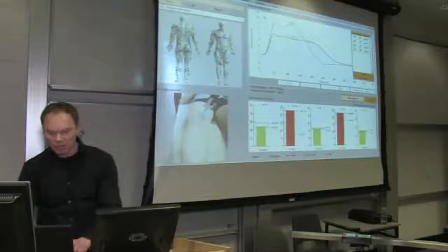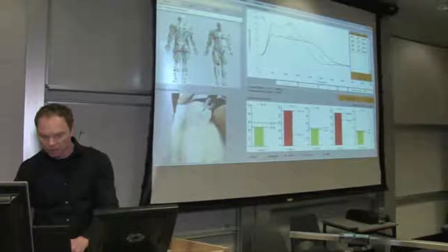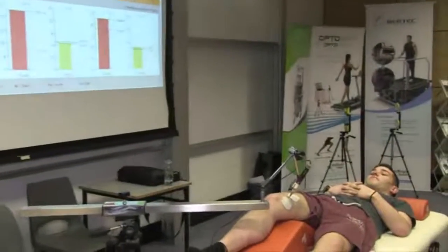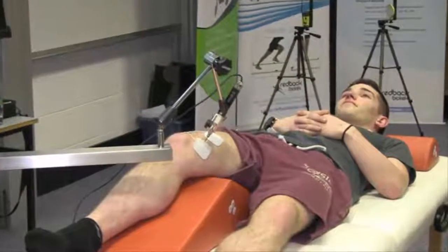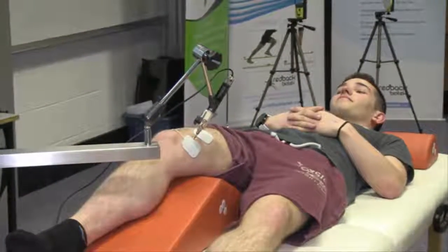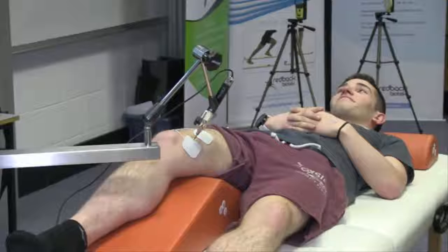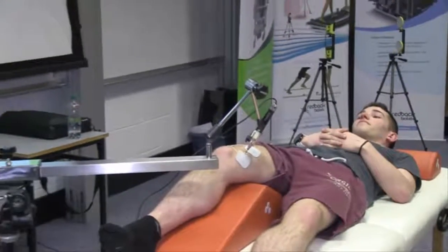What I'll do now, just to get a clear idea, is focus on the last and second to last, because this is what I'm interested in during the measurement protocol. I want to see two exactly the same responses, one after another, okay? So I'll go to 50, measure again. Now you can see there's almost no difference between 40 and 50.